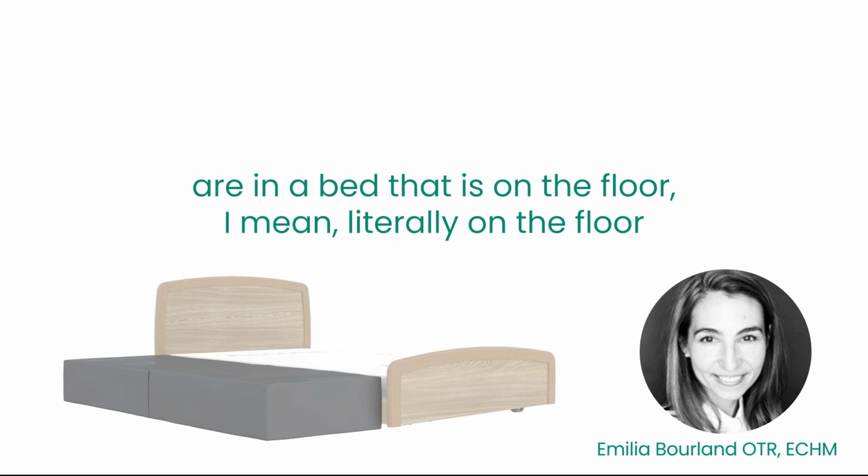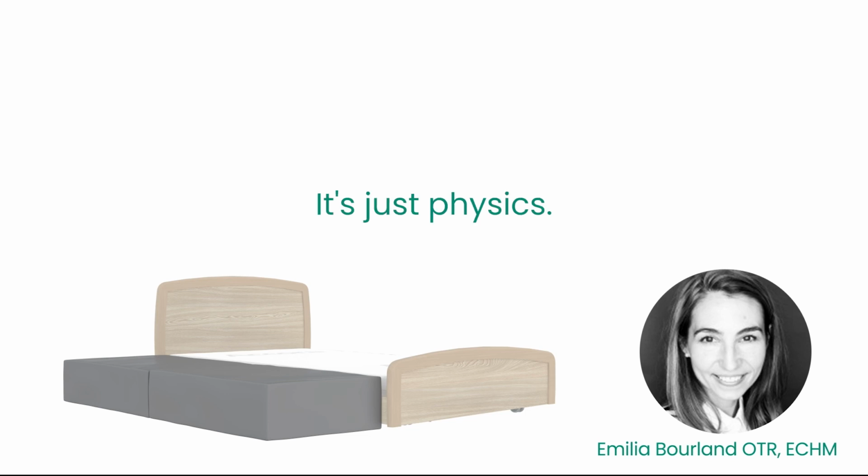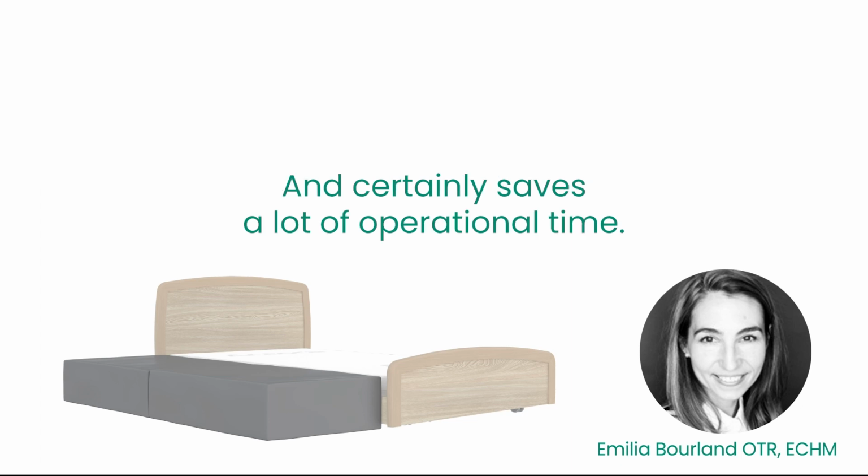If you are in a bed that is on the floor, literally on the floor, and there's a mat next to it, there can be no fall. It's just physics. There's nowhere to go. He's going to roll onto a mat, and then this becomes a non-issue, and certainly saves a lot of operational time.